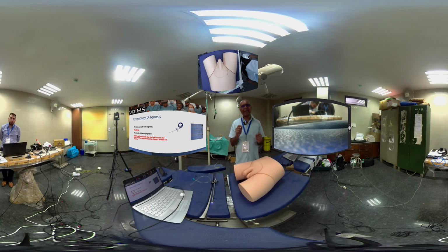The most important diagnostic tool for urology, especially for the lower urinary tract, is cystoscopy. We learnt at the beginning that the conventional cystoscopy is expensive because it has three components. The most expensive part, which is the telescope, then there is a bridge, and also there is a sheath which varies in several sizes. And then on top of that you need the camera, the light source, the monitor. All these things make it so expensive. It is difficult for non-urologists to afford it.